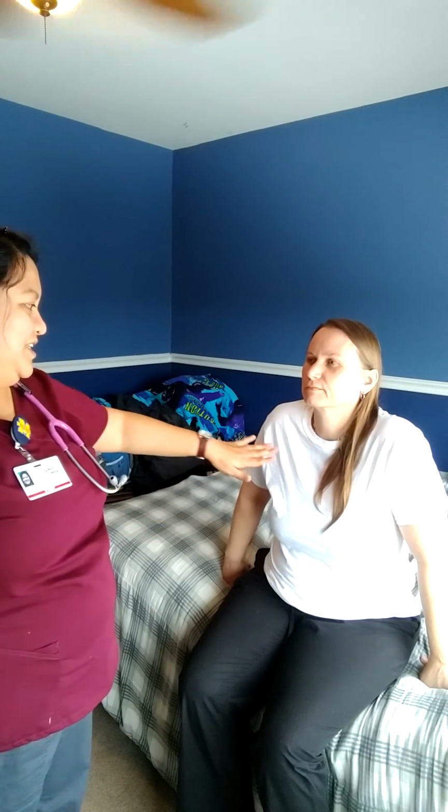Okay, I need to sit down now. And I will auscultate the lung sounds on the front area too. Same location, the second intercostal space, and the fifth intercostal space. Just take a deep breath.